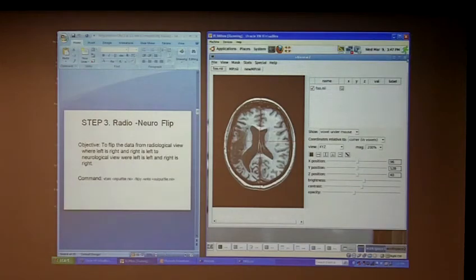I don't know. We don't trust the orientation information in the DICOM file. The only actual information in the DICOM file that's relevant is probably the position of the person in the bore of the magnet, which in our case is always head first supine, which means they're on the back of the head with the face up. Beyond that, the DICOM file doesn't include anything about the position of the subject. Since that's pretty constant for us, we can pretty much ignore it. But on general principle, if you're getting DICOMs from elsewhere, I wouldn't necessarily trust them to always be correct.